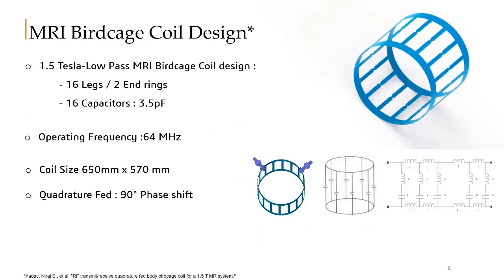We move next to introduce our studied birdcage MRI coil design. Birdcage coils are a type of volume coils which are widely used for MRI applications to provide a homogeneous magnetic field. Also, when this particular birdcage coil is quadrature fed, the field homogeneity is improved. So, our 1.5 Tesla static field low-pass MRI design operates at 64 MHz and it consists of 16 parallel conducting strips made of copper, surrounded by two circular end rings with a diameter of 65 cm and total length of 57 cm, and equipped with 16 capacitors of 3.5 picofarad for the low-pass design. Quadrature feeding is used to achieve a homogeneous magnetic field through two excited ports with 90-degree phase shift in excitation and also in position. The CAD part is done using SolidWorks.